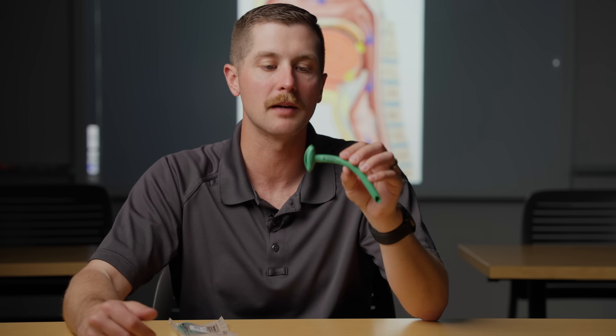There is a possibility that this will make somebody throw up. It's relatively uncommon, but somebody with a higher level of consciousness could trigger a gag reflex and you could have a much larger airway issue. So be prepared to reposition them if you have to — turn them on their side, especially if they have spinal immobilization applied. Have that pre-planned beforehand, or have your suction ready to go. With all of that being said, let's take it to the table and I'll demonstrate a live insertion.